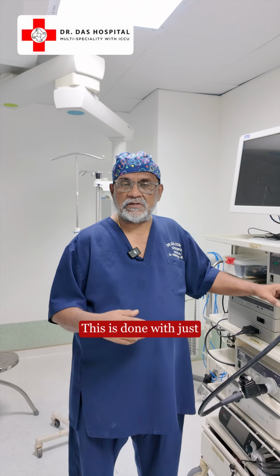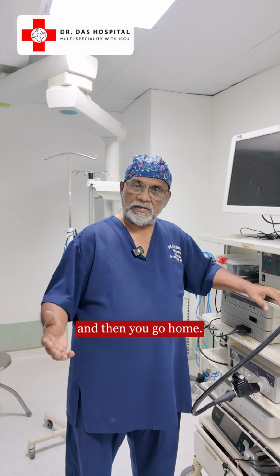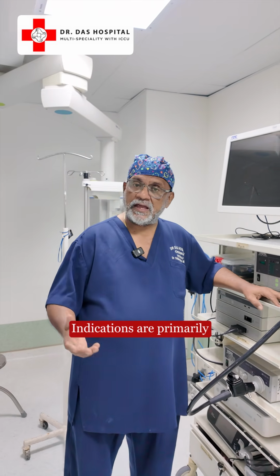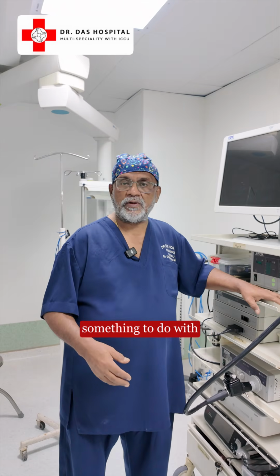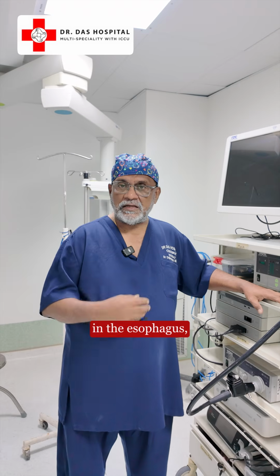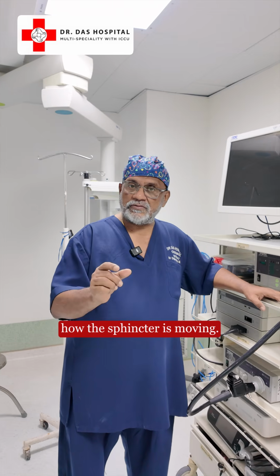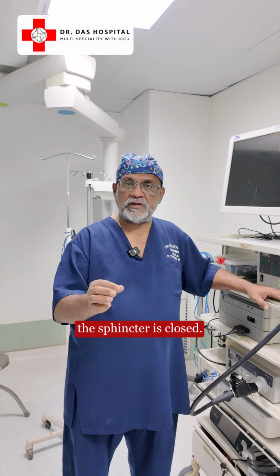This is done with just local anesthesia. It's an OPD procedure. You come in, we do the scopy, and then you go home. What are the indications? Indications are primarily something to do with obstruction to the foods going down your throat. If you have any obstruction in the esophagus, then you see the lower end of the esophagus and you see how the sphincter is moving. Normally in inspiration, the sphincter should close.